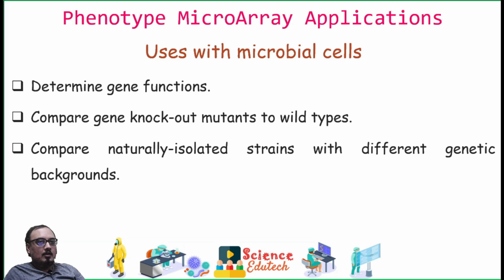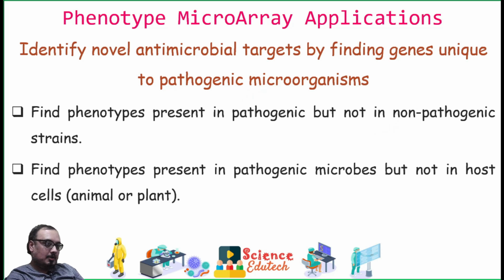So finally, the applications. Phenotype microarray applications, basically with the use of microbial cells, can help us to determine gene functions, compare gene knockout mutants to wild types, and compare naturally isolated strains with different genetic backgrounds. They also help us to identify novel antimicrobial targets by finding genes which are unique to the pathogenic microorganisms, and find phenotypes present in the pathogenic but not in the non-pathogenic strains.